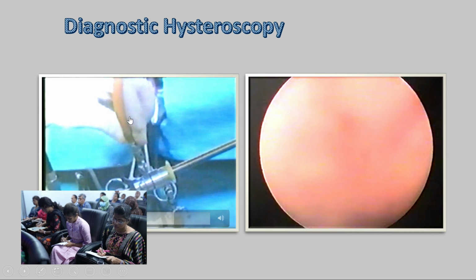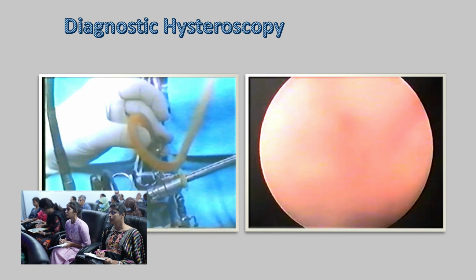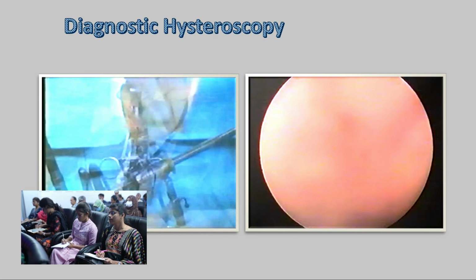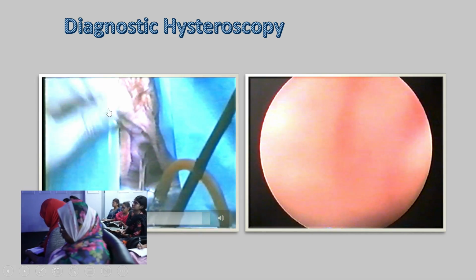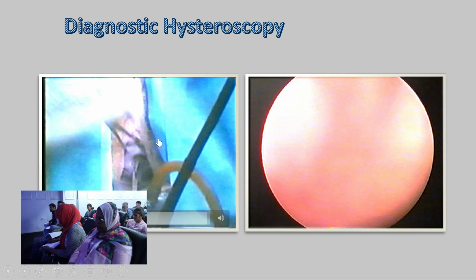and it cannot dilate, you will bleed, and after that blood is the biggest enemy of hysteroscopy. Your vision is lost, because red color absorbs all the light. So very good dilatation, careful dilatation is required.